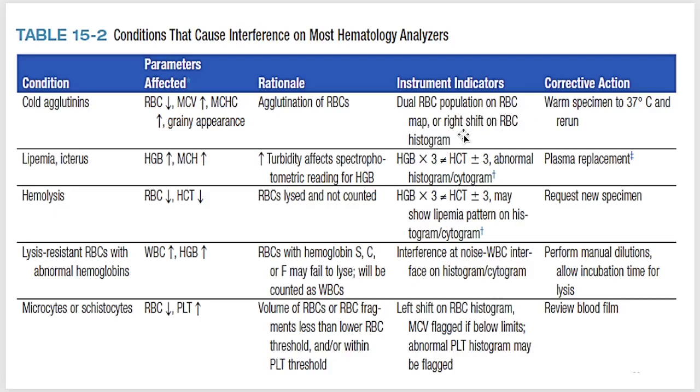There's already macrocytosis, kasi nagkukumpul-kumpulan ang cells, nagmumukhang malalaki ang ating cells. Kaya macrocytosis. Dual RBC population, anong nakikita natin sa ating histogram dito? There is a dimorphic population, or therefore there is presence of two different sizes of your RBC. Dalawang population or sizes ng ating RBC.